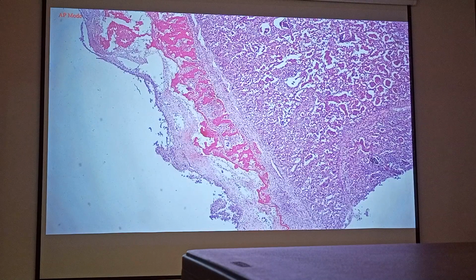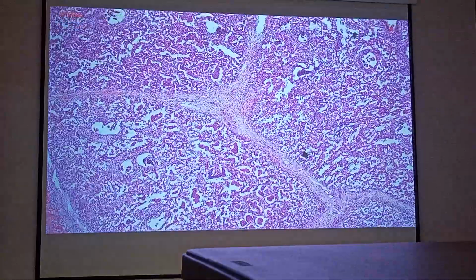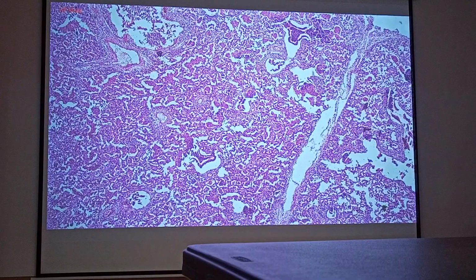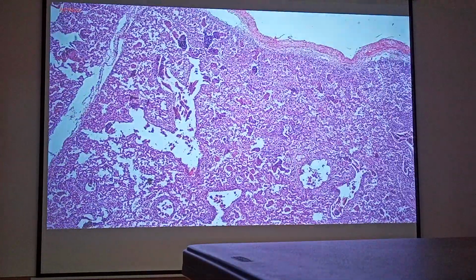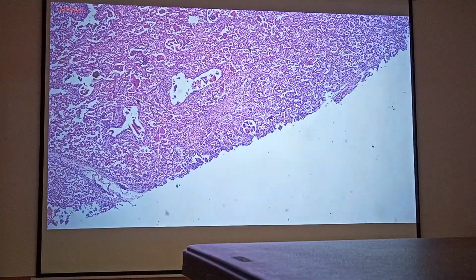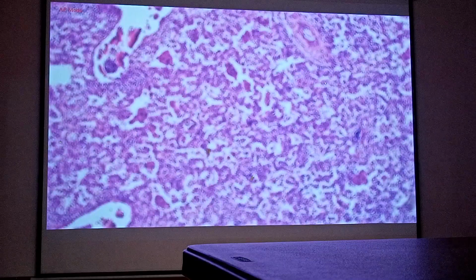Now, in this portion of the field, to your right, this is actually a lung tissue. Okay? Lung tissue. Let us begin first with the study of the tissues of the lungs. You have seen the histology of the lungs already. So, you will not be able to appreciate it anymore. It will be very difficult to identify this organ as the lung because of increased cellularity. Okay, there is increased cellularity. Let us zoom in to higher magnification.